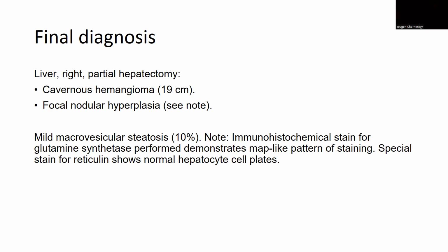I was surprised that when I showed these MRI images to my senior people here, they all put the diagnosis as angiosarcoma. You didn't do the frozen, it was a colleague of yours, 20 years ago? Almost 20 years ago. I was a young attending. It was a well-known gastroenterologist.